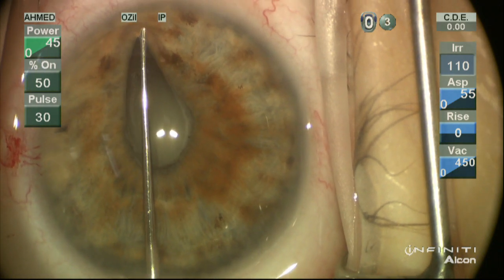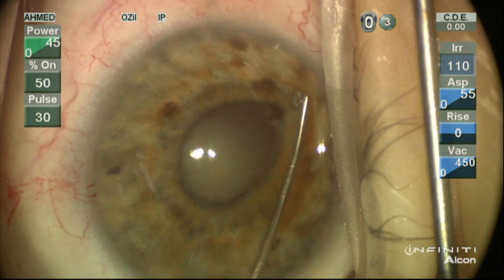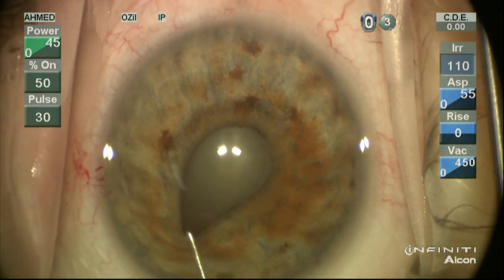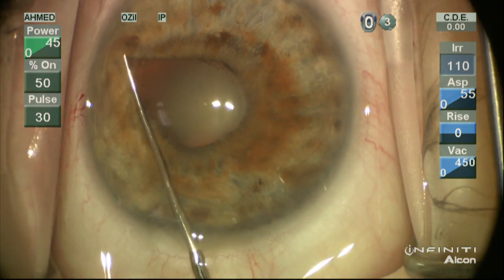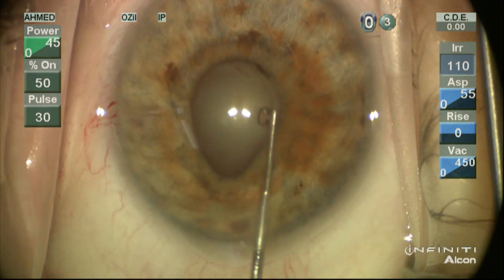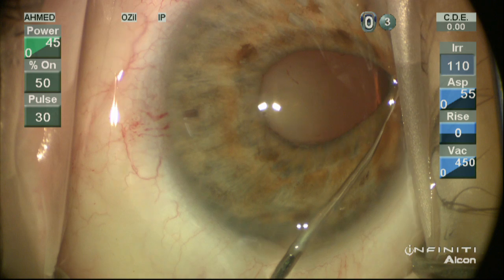To release the posterior synechiae, which are present, we'll use a Kuglin hook to simply spread and release the synechiae present for 260 degrees around the pupil. For preference, we'll use a single-handed stretch as opposed to a bimanual stretch to avoid excessive tearing of the iris sphincter and pupil trauma. You can see all of the synechiae released here.